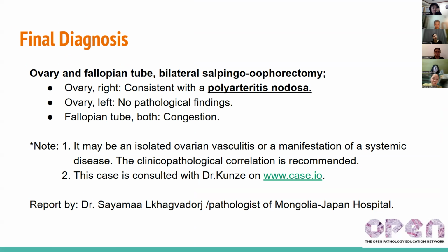Konzi, because we weren't sure about this case since it was quite complicated, and our teacher consulted this case with other professors and other pathologists, so they made the final diagnosis of polyarteritis nodosa, and we didn't find anything about the cyst, and there were no simple or other cysts in the ovary. So this is the final diagnosis. And next slide, please.